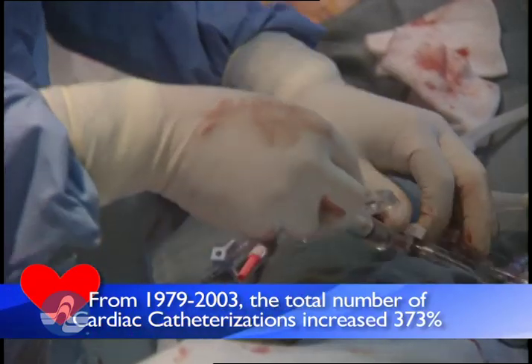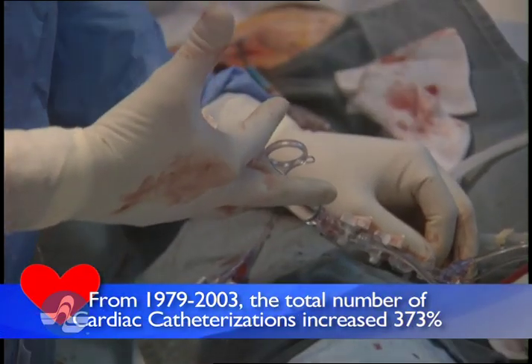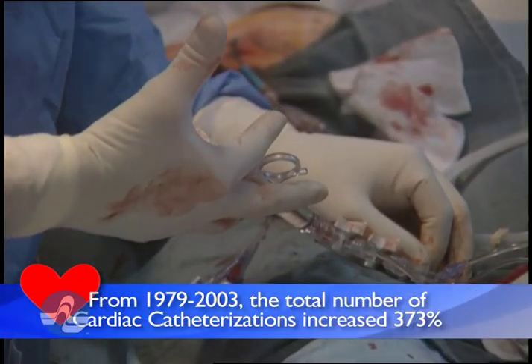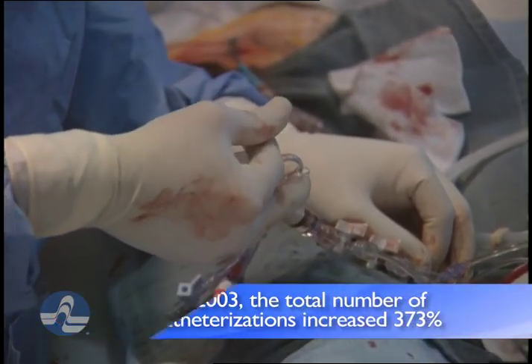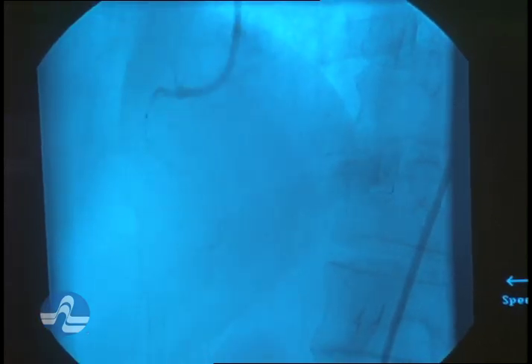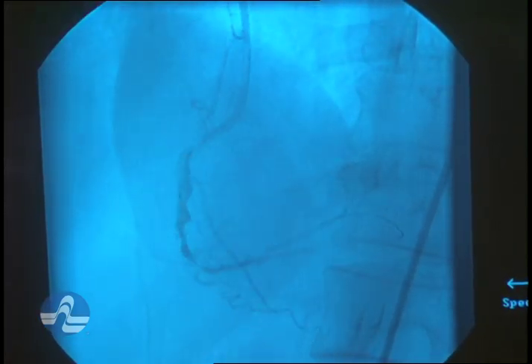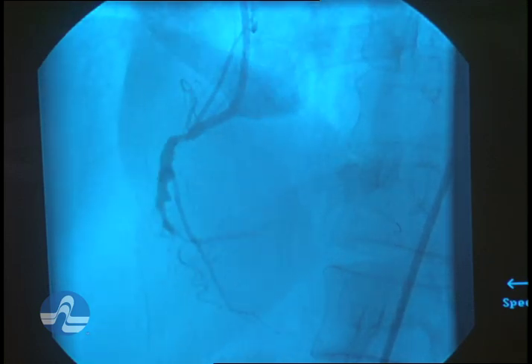Through the catheter, we then inject a substance called contrast dye, which shows up on x-ray, and we take x-ray movie pictures of the heart arteries. That allows us to determine whether there is a blockage.